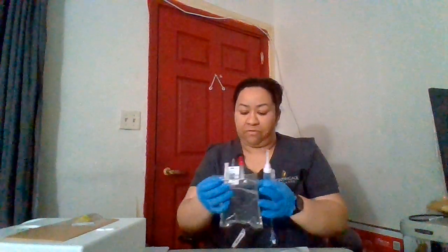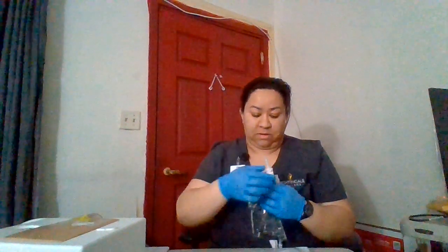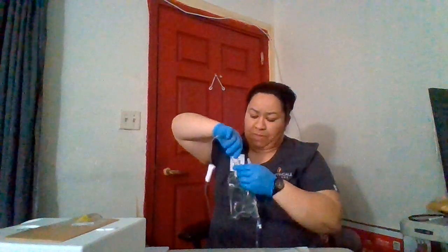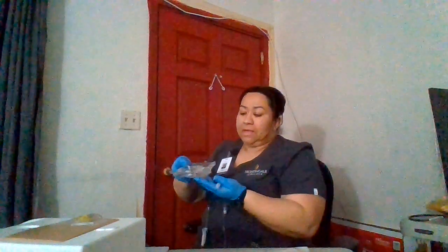Okay, so I'm gonna start off by getting my bag, taking off the cap, then getting my spike, taking off the cap. So I have spiked my bag, and now I'm gonna be hanging it.